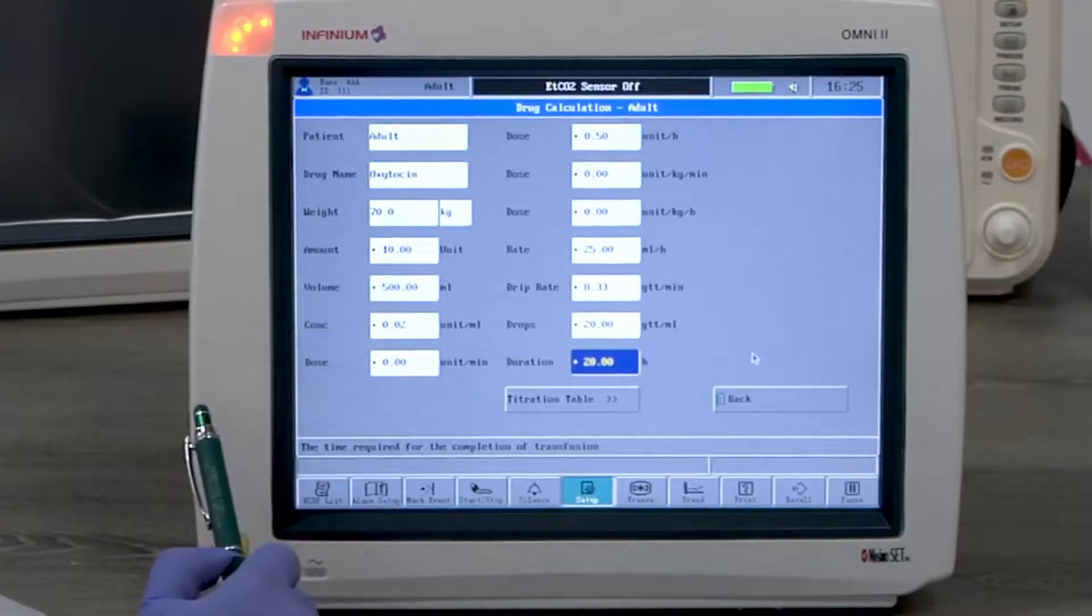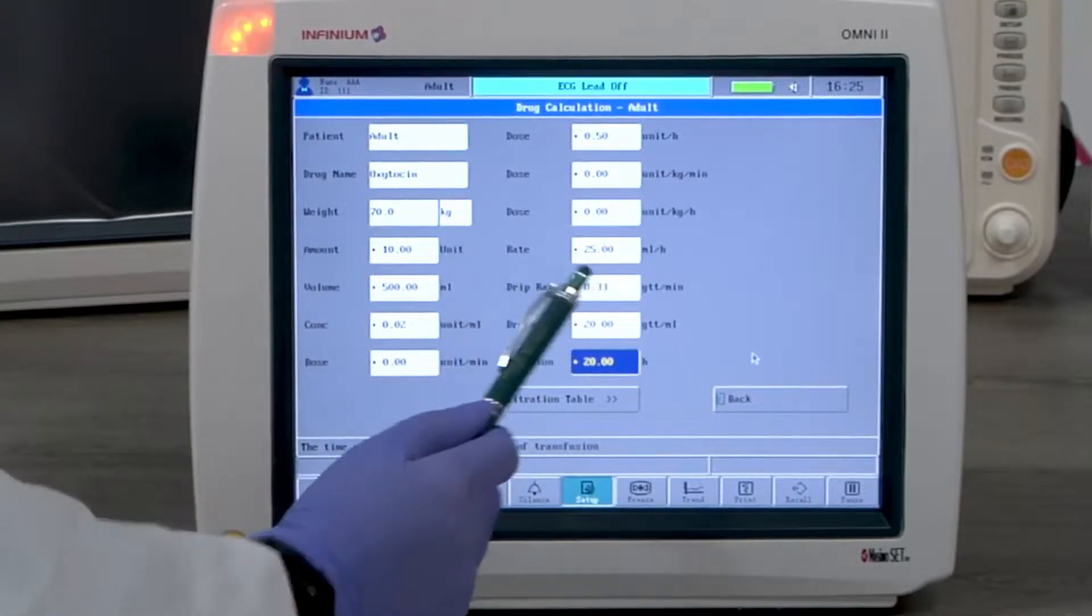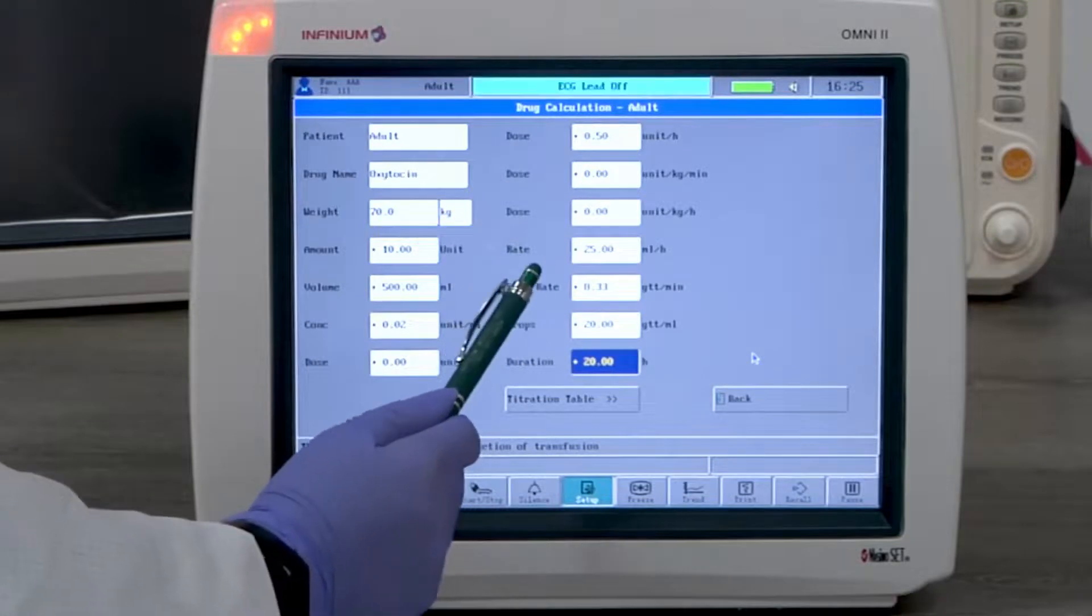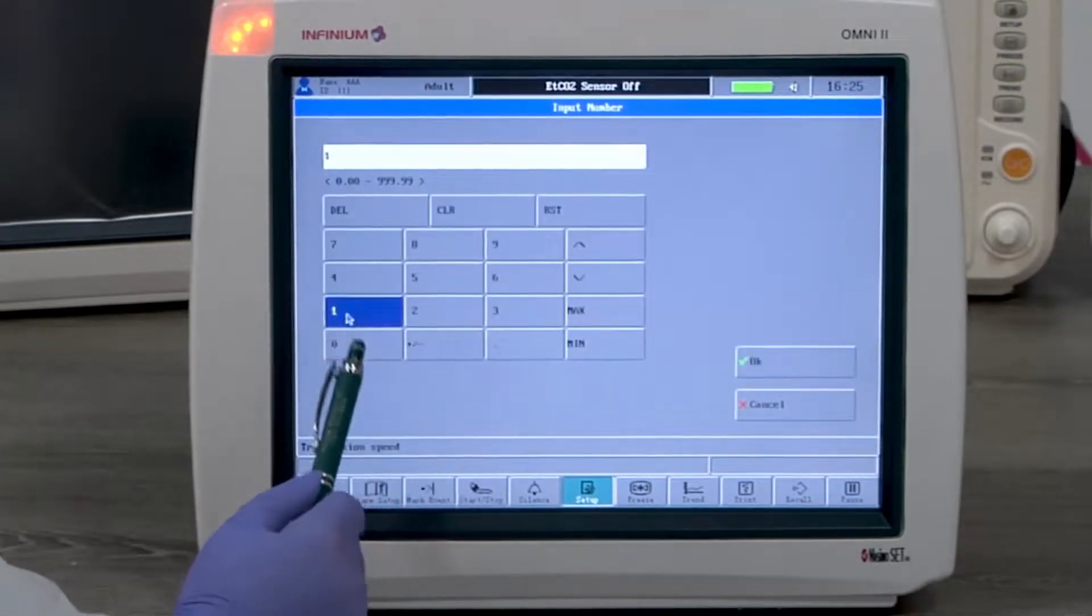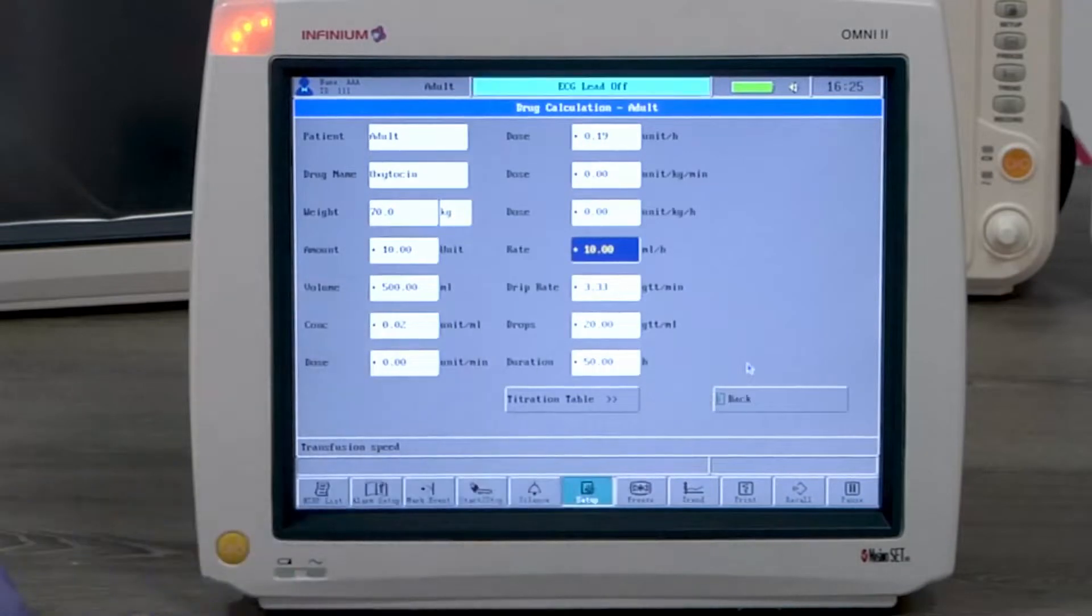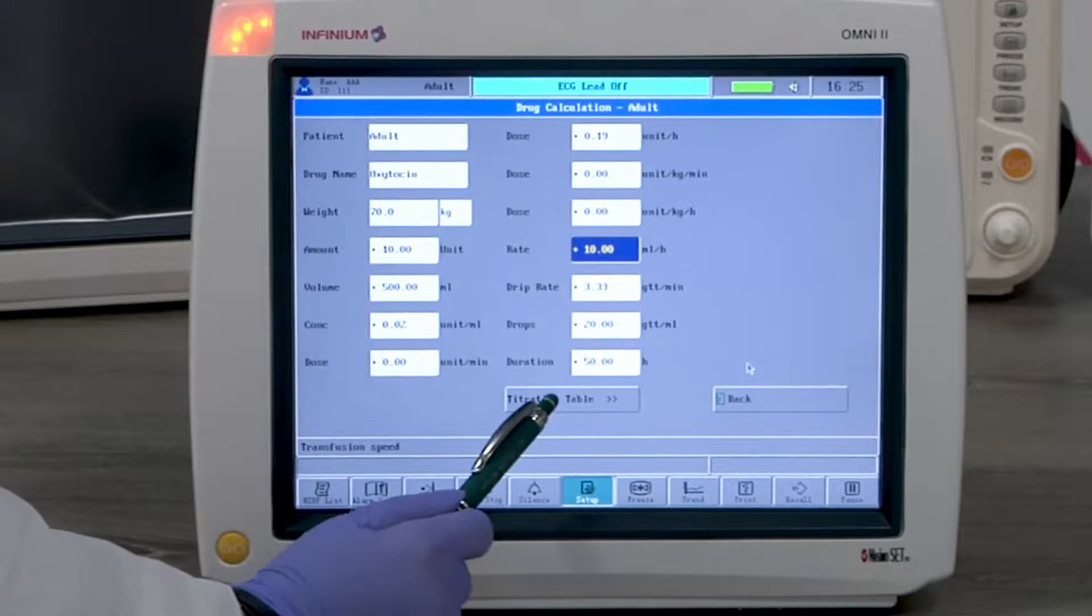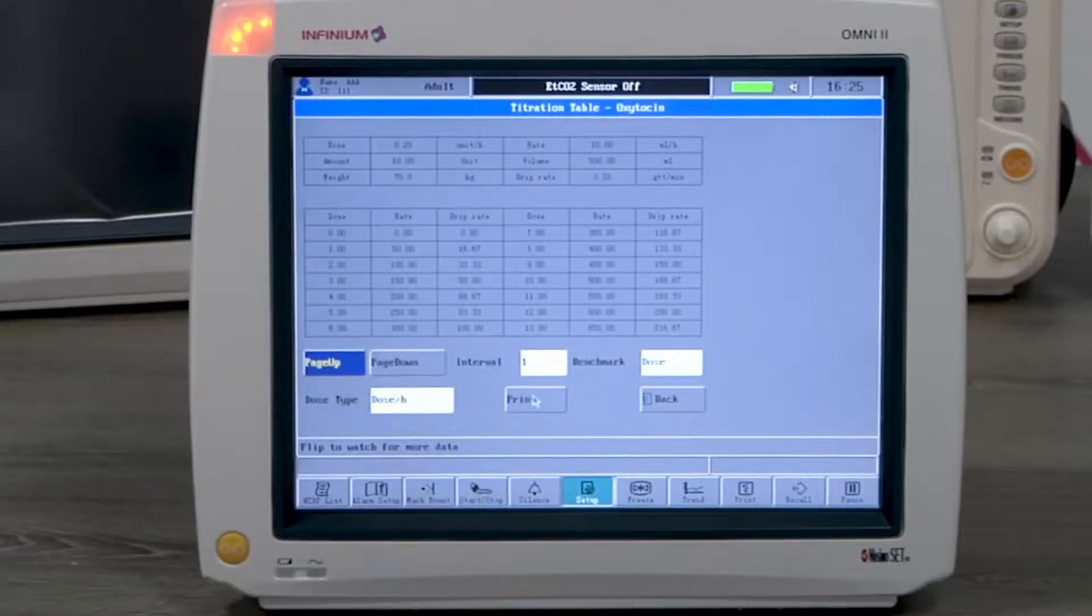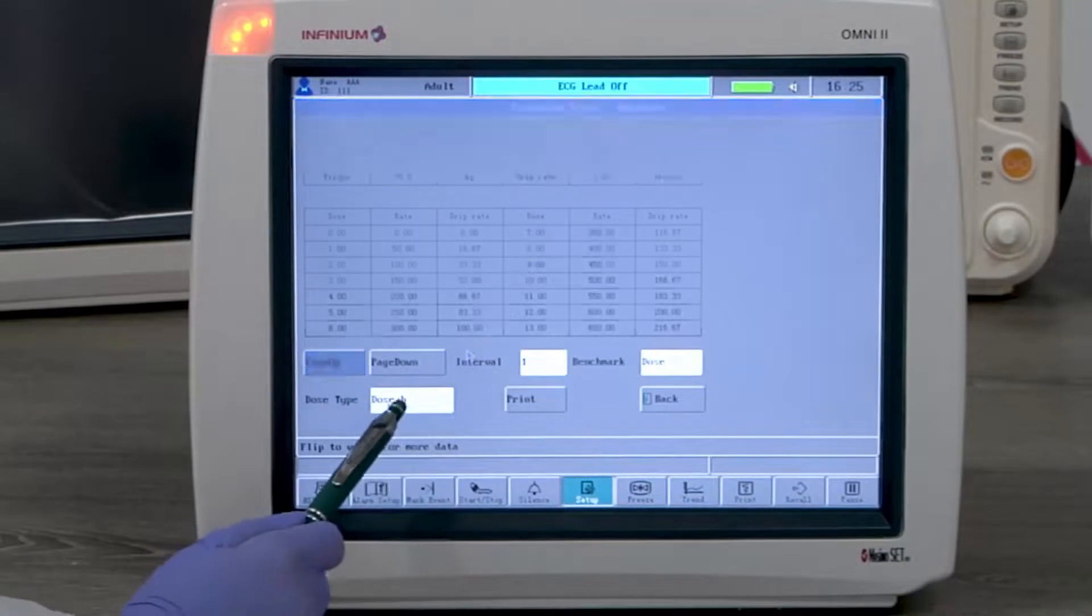Put in the duration. We can use 20 hours as an example. You'll see all the related calculations have been populated. If you want to change one certain parameter, for example, the rate needs to be set at 10 milliliters per hour, then all numbers will be recalculated accordingly. Once the numbers are input, you can go to titration table.